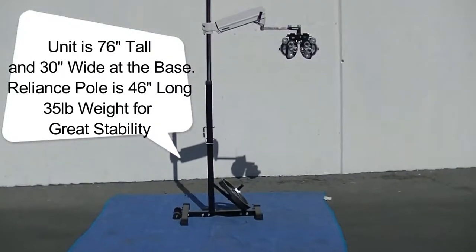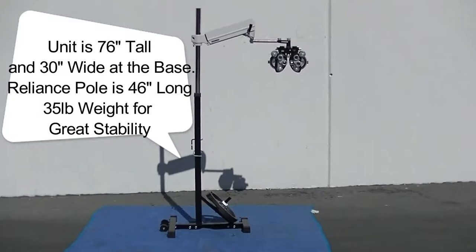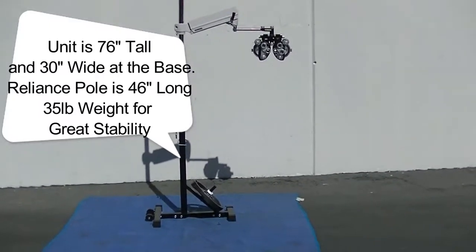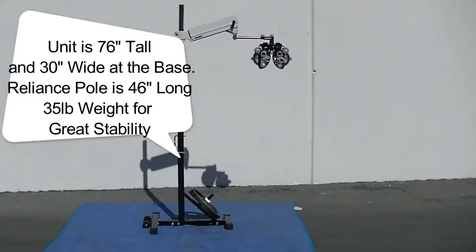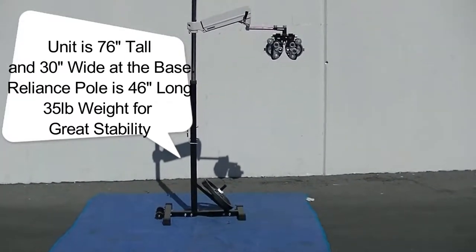This is the portable phoropter stand that we've been working on. I'm going to go up close to all the parts so that you can see it. It basically consists of about six parts, of which some can be kept together, others cannot.